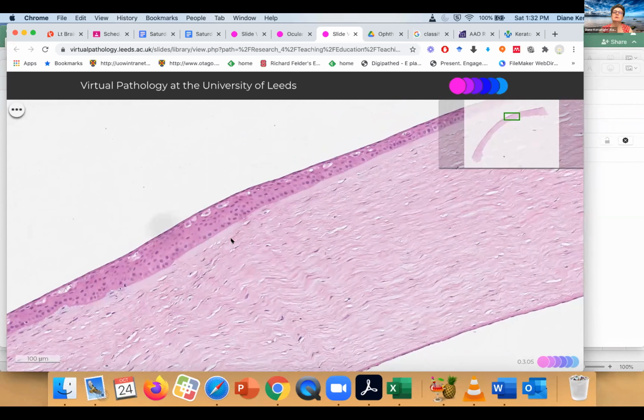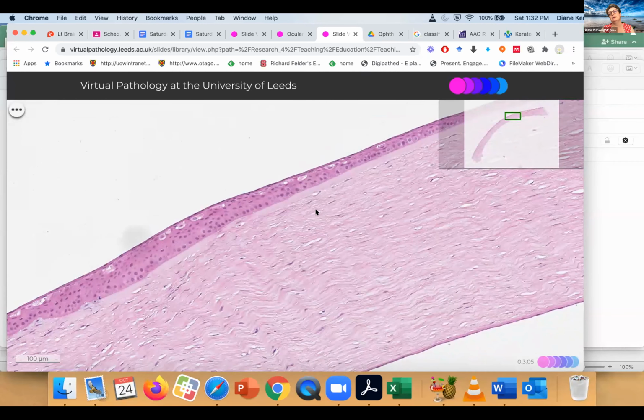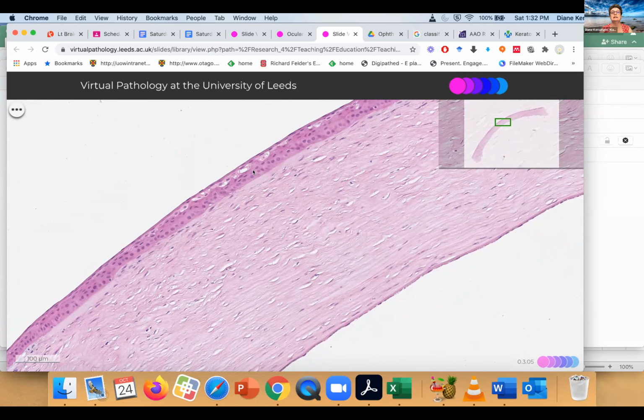I know some people were discussing whether or not this was a basement membrane dystrophy, but with the basement membranes intact, it's really quite okay. You know, we aren't getting little curls of it going up anywhere. I think herpes is a really, really good differential diagnosis for this. This is something that's had a chronic ulcerative and deep stromal scarring kind of condition happen to it.